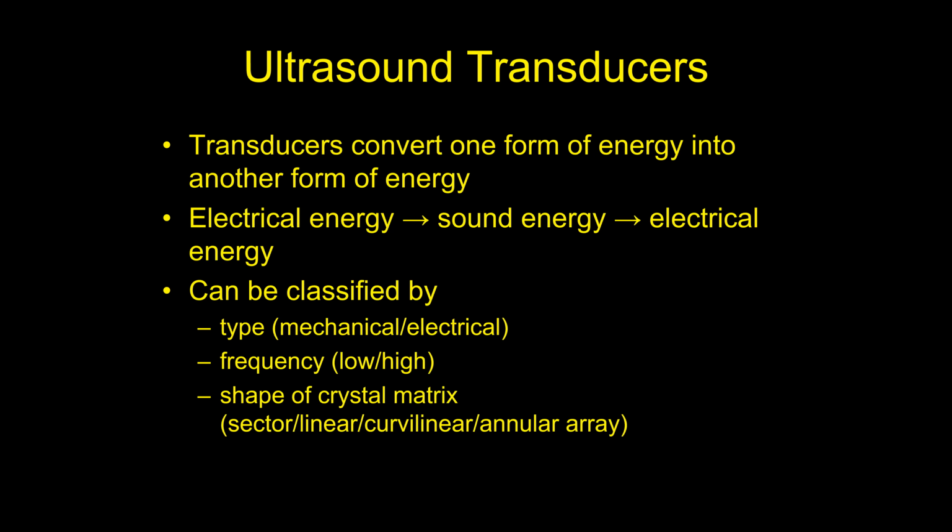That sound then reflects off of things, comes back to the probe, and the probe then converts that sound energy back into electrical energy, shoots it back into the ultrasound machine, which the computer then magically creates an image. Okay, so ultrasound transducers take electrical energy, convert it into sound energy, and then they're listening 99% of the time. They take that sound energy and reconvert it back into electrical energy.